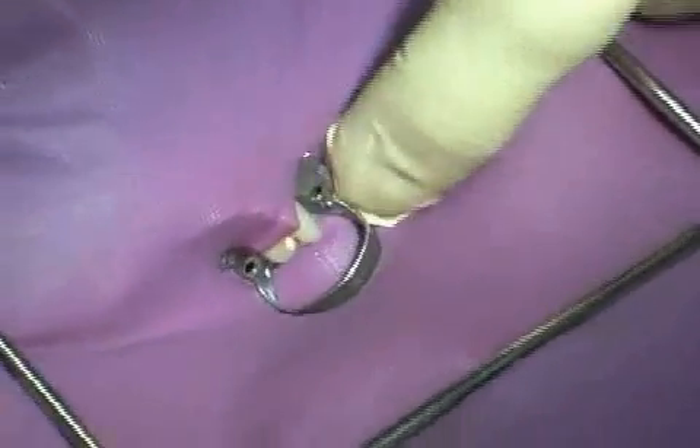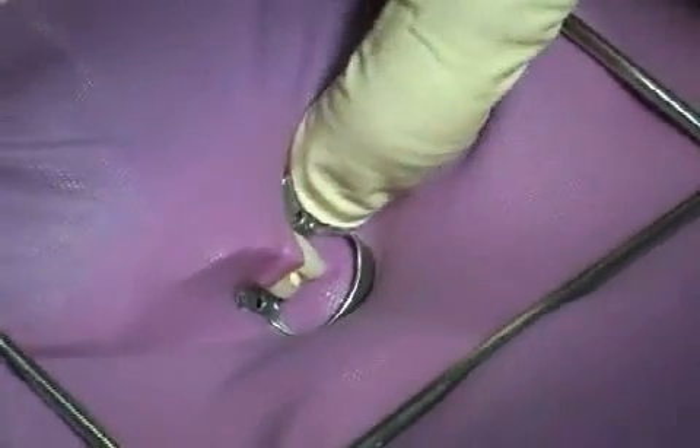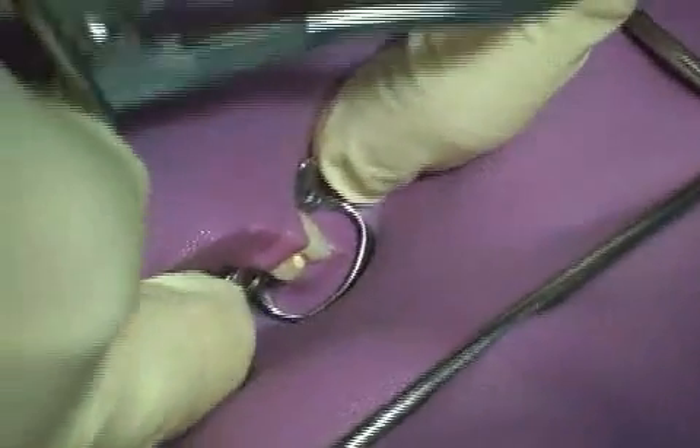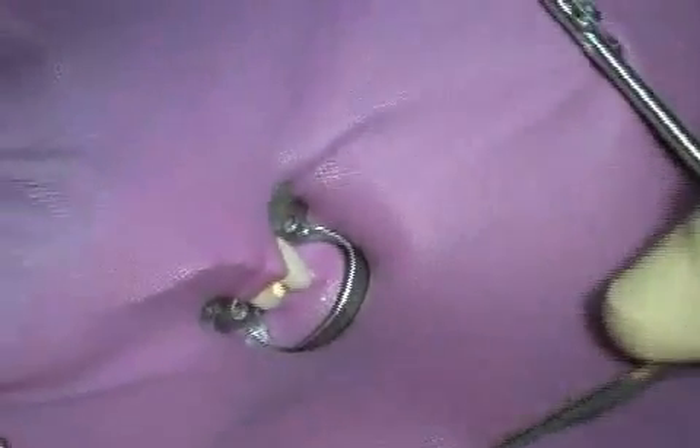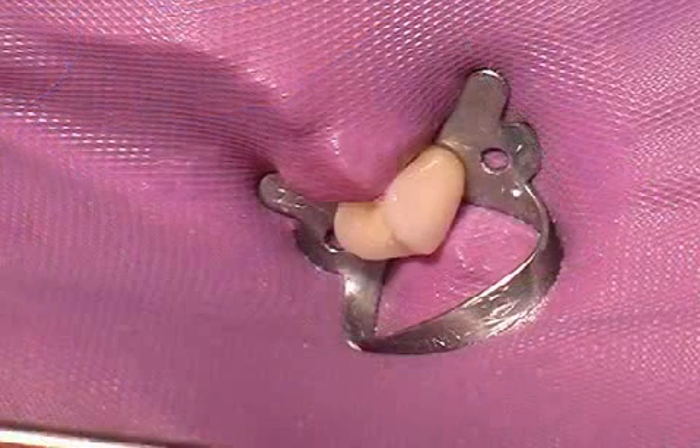Saliva contains many different bacteria that can threaten the success of a root treatment. In the picture, you see a rubber dam that isolates the tooth from the tongue, other teeth, saliva, and blood. This is an important prerequisite for a successful root treatment.